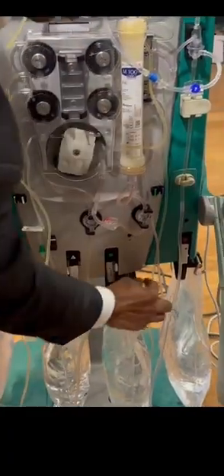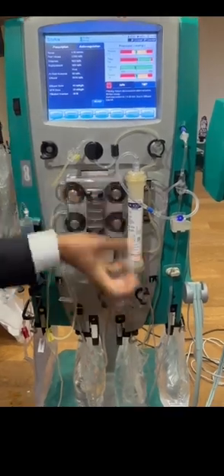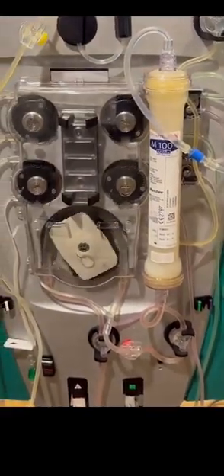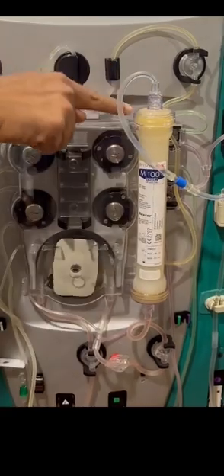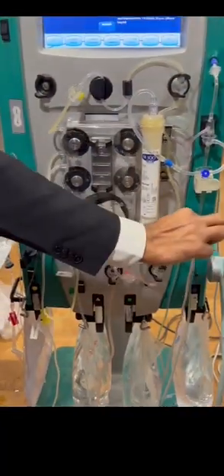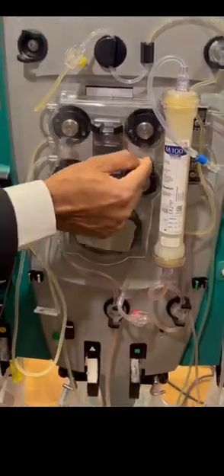Okay, now we have the dialysate line. It will collect dialysate from there, and the speed I kept is 800 ml per hour. Then it comes to this pump. This pump will suck the dialysate and give it to the dialysate compartment. Here it connects. In HD, we connect that coupling because the machine prepares the dialysate solution. Here it is already prepared, a ready-made solution that will enter into the dialysate compartment. That pump is over. These two we have covered. Now we have the replacement solution. The replacement solution, purple line from the purple scale, comes to this pump. It will come here.